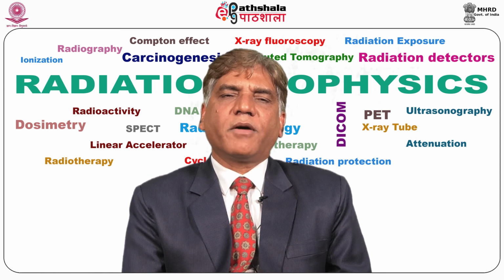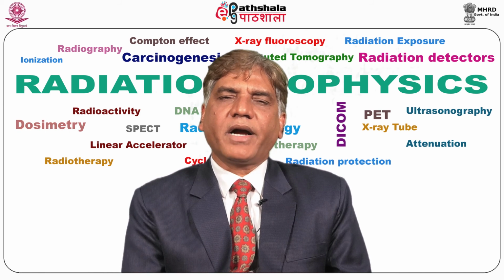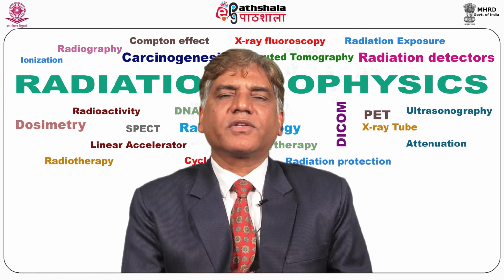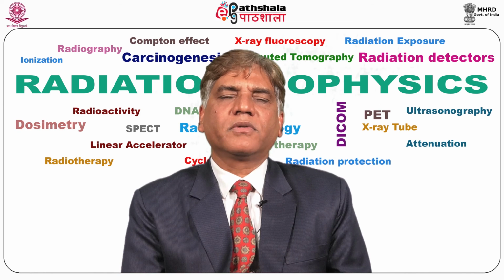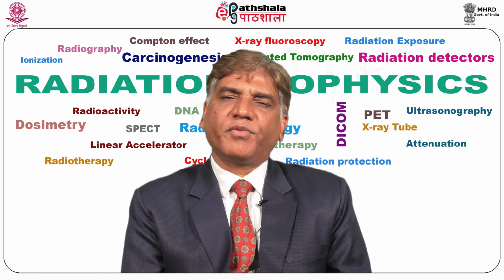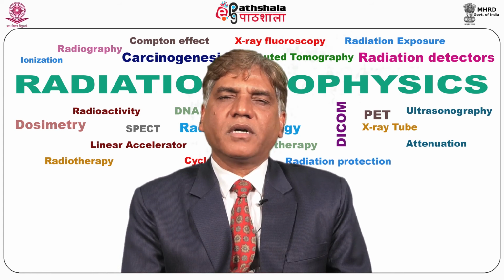Now coming to the component and architecture of PACS, it is defined as a system that typically acquires, stores, transmits, displays and processes digital images. The basic components can be separated into acquisition, for acquiring and pre-processing of images, so an image acquisition component is needed.